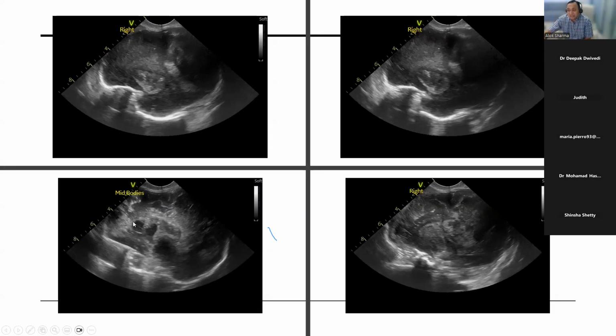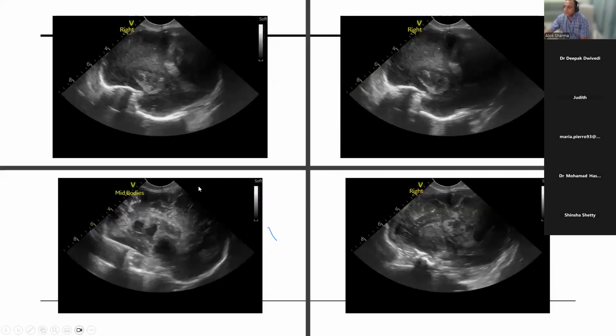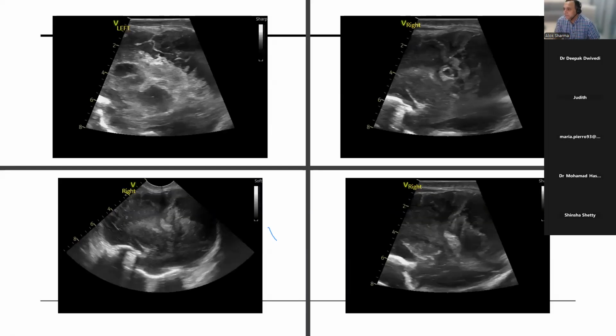This is the midline. Can you see the corpus callosum? No. It's completely destroyed. And you can see all this exudate? Yes. It's a horrible scan. So the dark spots are the necrotic areas. Liquefactive necrosis has happened. It's basically cortical hemispheres breaking down.